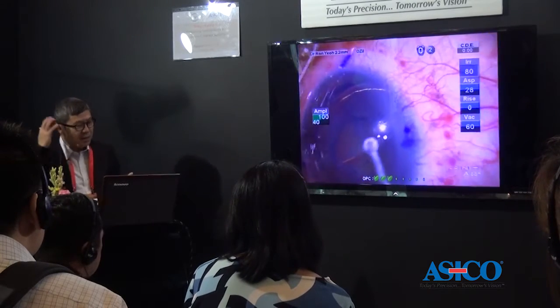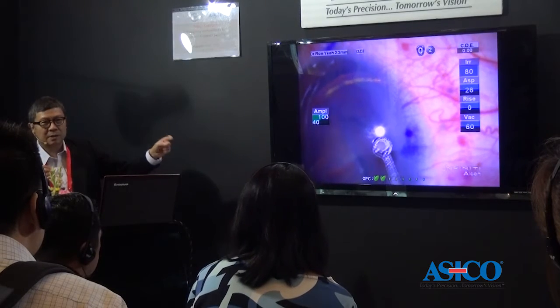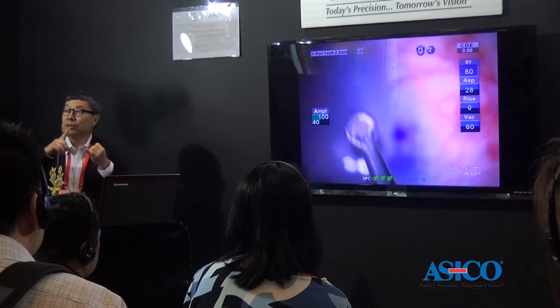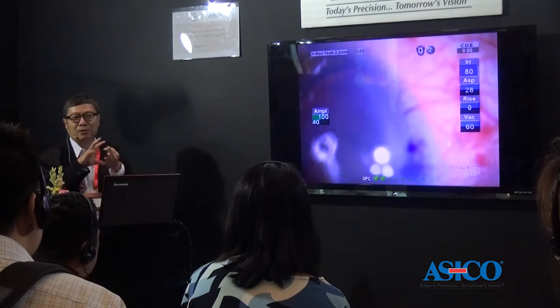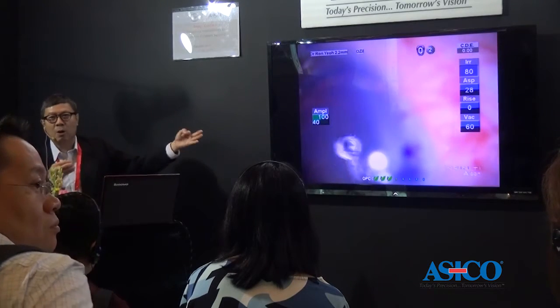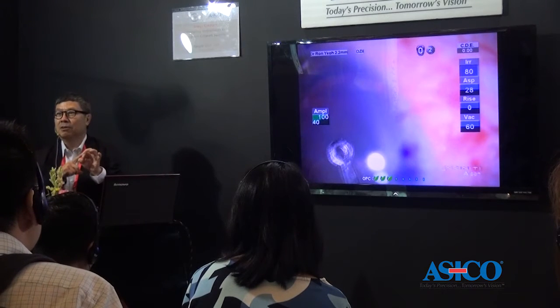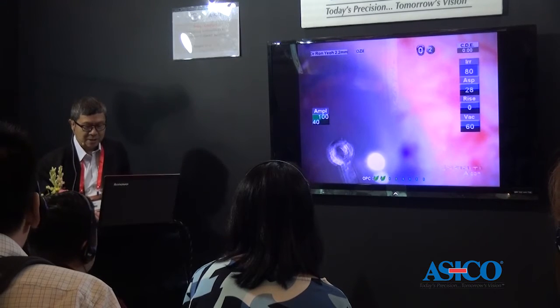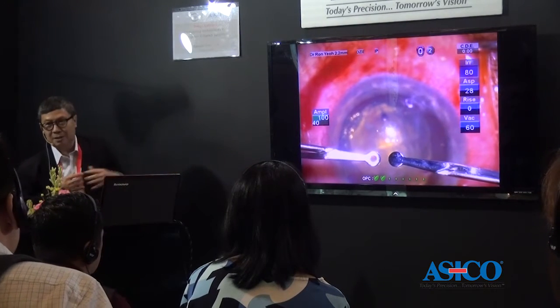But then one day, my nurse gave me my instrument for the next case, and you see in the middle of that hole, there was a plug of nucleus left from the last case. It meant they weren't doing their job properly. They didn't clean my instrument properly, or the autoclave didn't work properly. But I said, oh my God, why? Why do we need a hole in this instrument at all? And if you think about it, if you fill in that hole, you're actually going to be more effective cracking the nucleus. And then you won't get that problem of nucleus stuck in the hole.